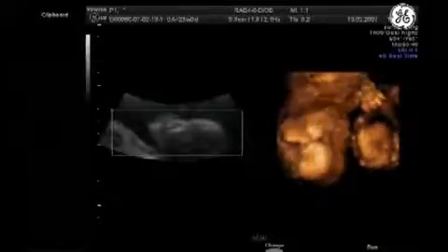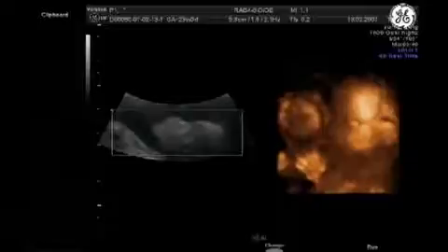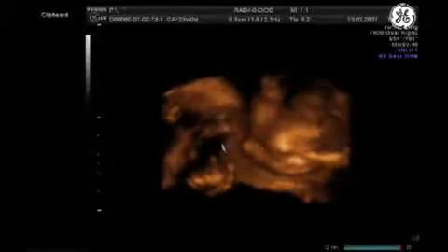Okay. And during the acquisition, I play also with the gain. You can see here, too much gain, and you reduce. Okay. Now, I will cut around the fetus with a magic cut. I can cut this part behind the fetus.